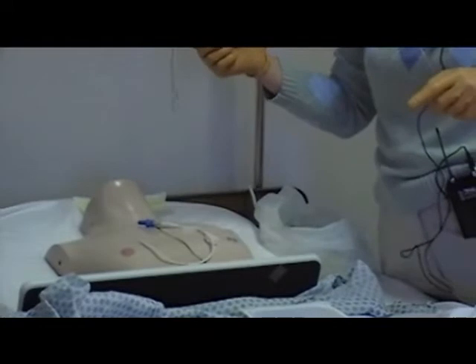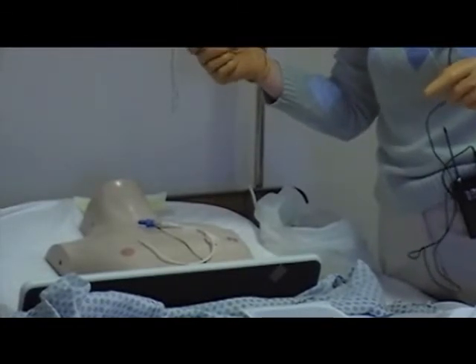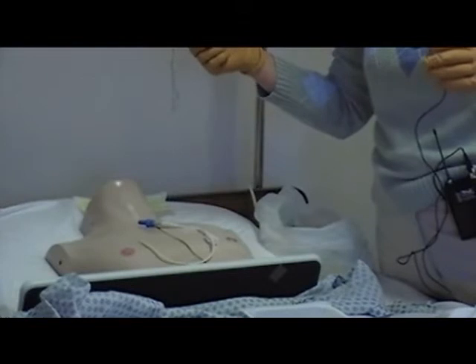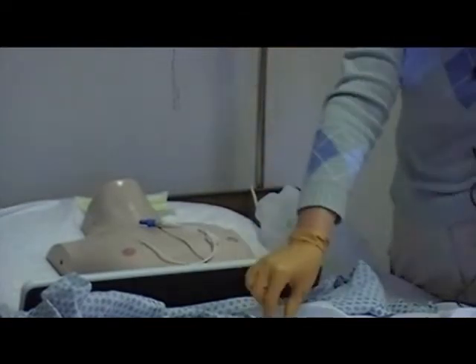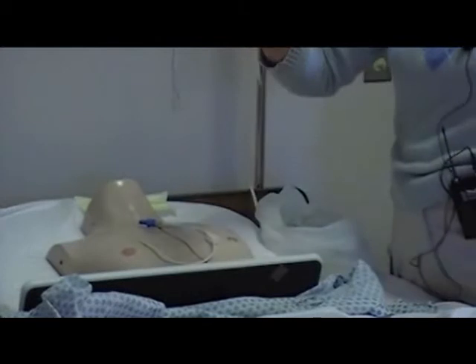The majority are usually a 30-second scrub, but it varies anywhere from a 15-second to a 2-minute scrub, depending on the policy that you're looking at. 30 seconds is kind of the standard. So at that point, I'm going to go ahead and discard that. And I'm going to need now my Opsite, which I can actually grab myself out of the package.